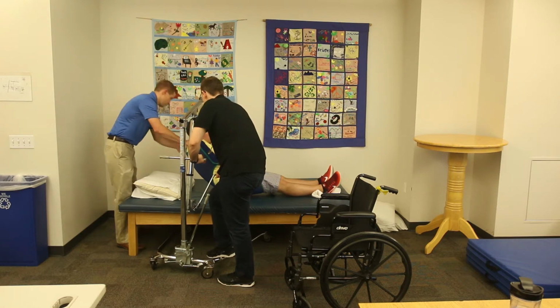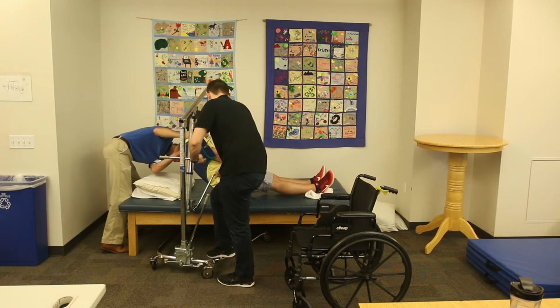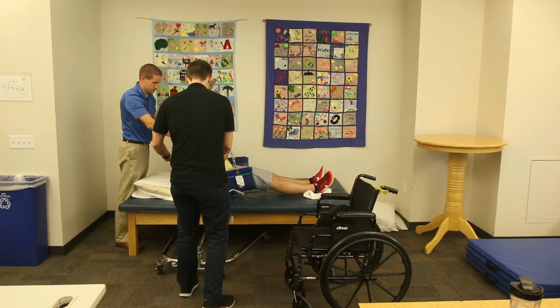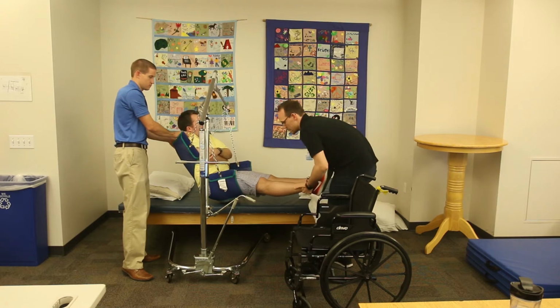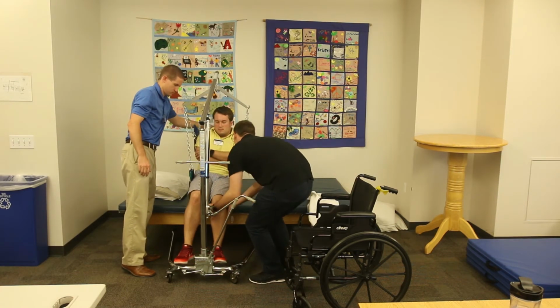Is his bottom off the mat there, Dylan? Not yet. Not yet. Right there. Right there? Yep. All right, keep holding his neck there. I'm gonna wheel him out a little bit, and I'm gonna position his legs. All right, Richard, I'm gonna just help straddle your legs over this.